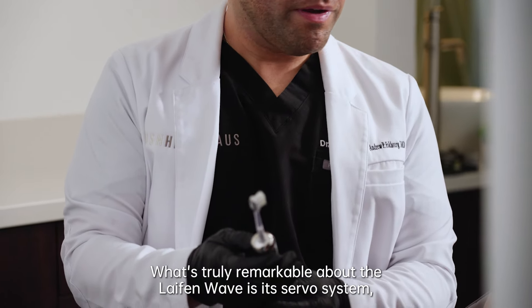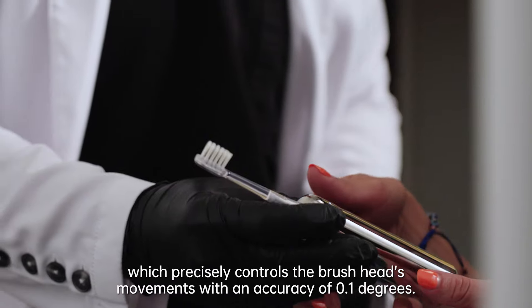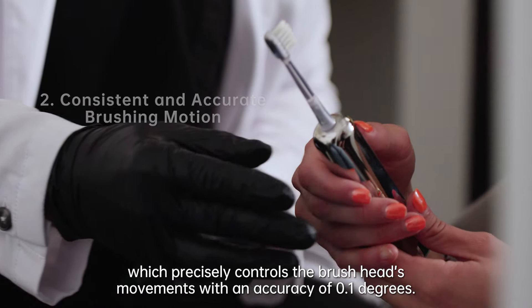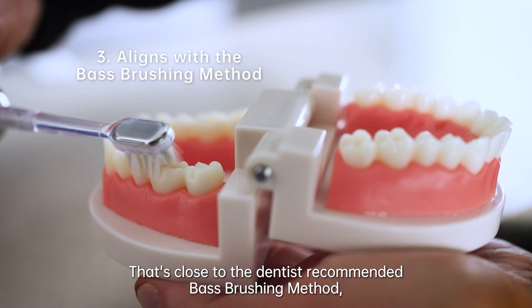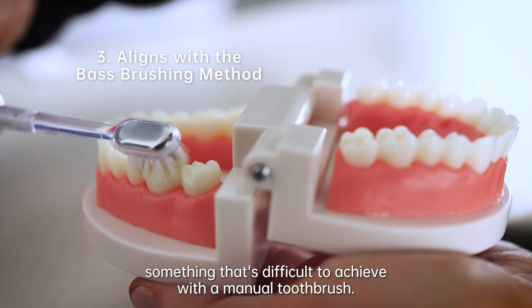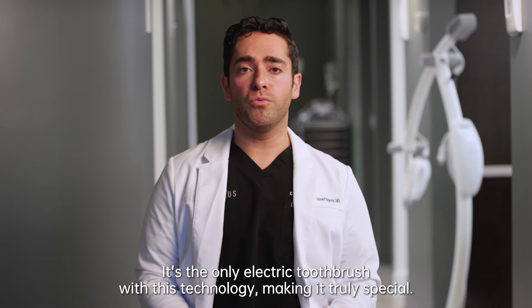What's truly remarkable about the Laifen Wave is its servo system, which precisely controls the brush head's movements with an accuracy of 0.1 degrees. This ensures consistent brushing power and motion — that's close to the dentist-recommended Bass brushing method, something that's difficult to achieve with a manual toothbrush. It's the only electric toothbrush with this technology, making it truly special.